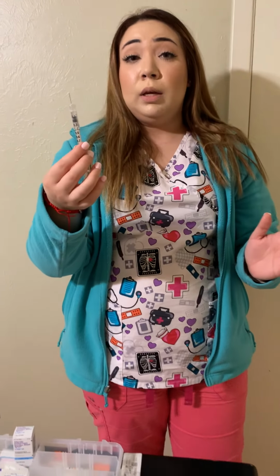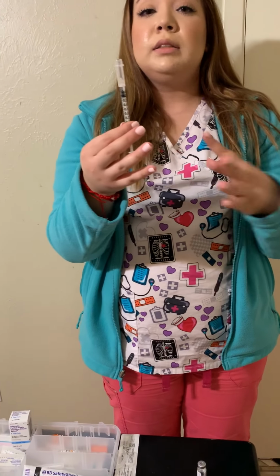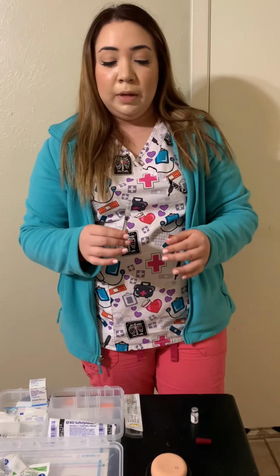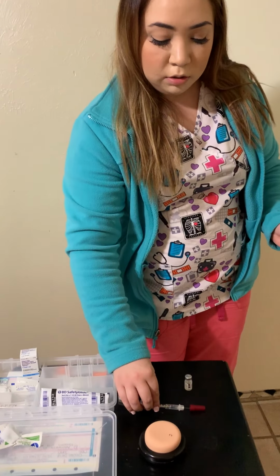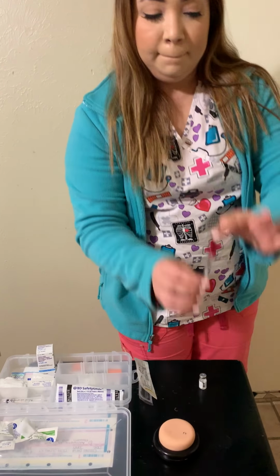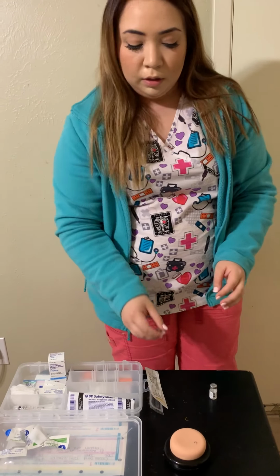Now, most needles or syringes come with a safety guard, like mine. So if you are preparing this outside of the room, you can just slide your safety guard back up and then take the syringe back into the room. If not, you can always use the one-handed scoop method, like so, and then just snap it on.